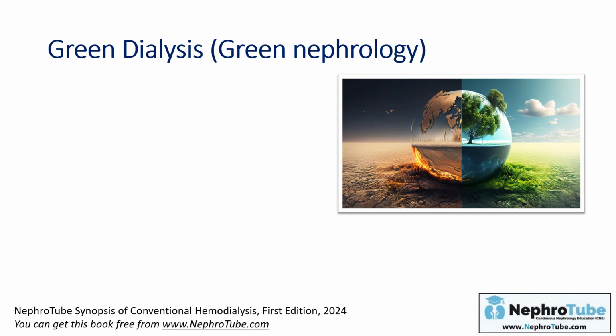And this highlights our critical role as nephrologists to try to make healthcare practices eco-friendly. And there are some suggestions on how we can make dialysis green. Green means that it meets the global needs to maintain the global natural environment. For example, we can repurpose the rejected water of the RO. Actually, a large volume of water is rejected by the RO and it goes through the drain.